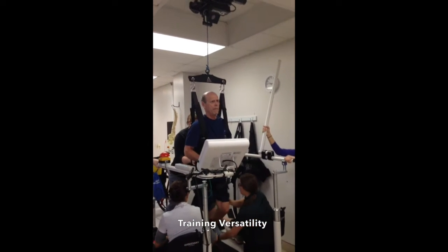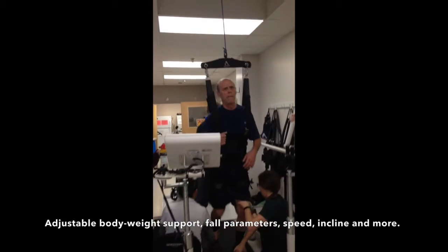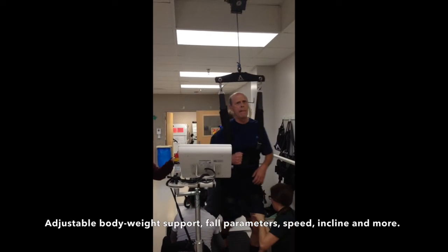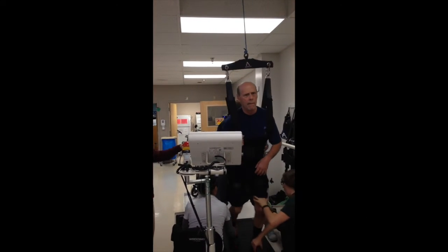Training is highly versatile. With a touch of a button, therapists can adjust the level of bodyweight support, fall parameters, treadmill speed, incline, reverse, and more for session variety.